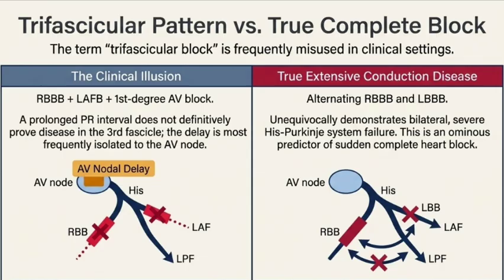And because it arrives so late to the blocked side, it drags the overall average direction of the electricity off-center. Spot on. That U-turn creates a massive lopsided electrical shadow. In cardiology, we map the heart on a 360-degree compass called the hexaxial wheel. Okay. When the signal is forced to take that slow cell-by-cell U-turn toward the blocked area, it physically shifts the average direction of the electricity on that compass. We call that an axis deviation.